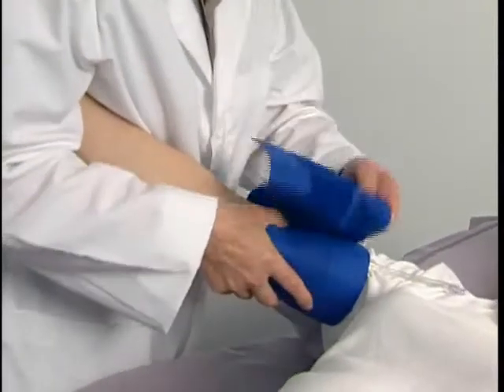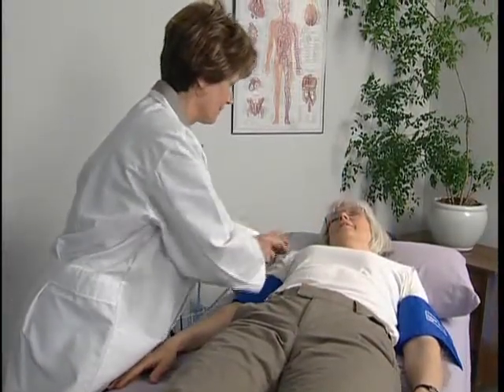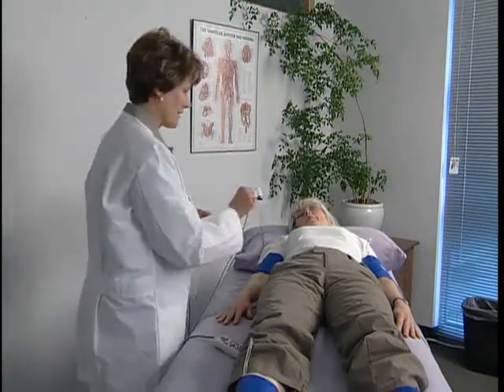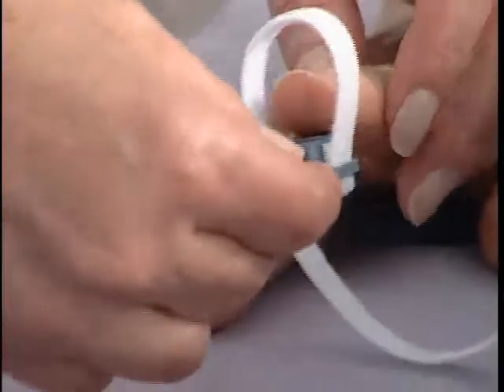Wrap a cuff at each arm to prepare for the exam. Use the appropriate size cuff based on the circumference of the limb. Start at the right brachial artery site and connect the hose to the cuff. The Doppler probe can be used to obtain brachial pressures for a TBI, but in this example we will use the PPG probe.